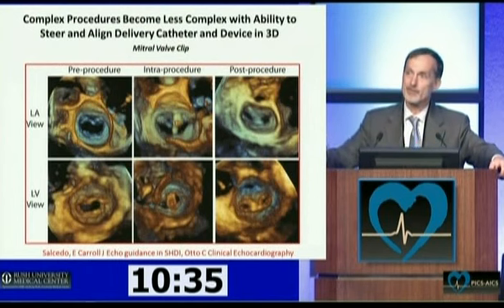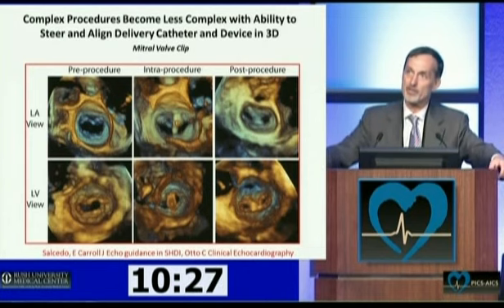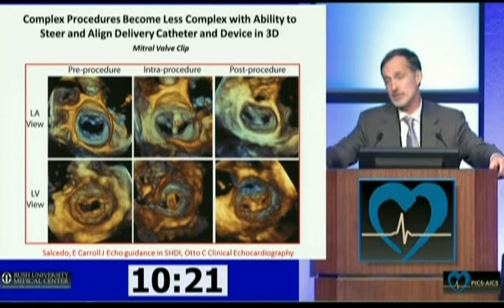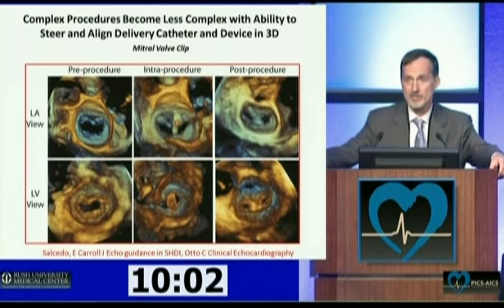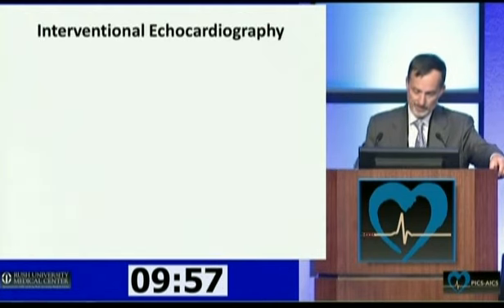And we have had very clear anecdotal but broadly agreeable changes in the complexity of interventions because of the challenges really more of image guidance, and MitraClip really is the prototype around the world of a complex intervention that's become easier because of better imaging. That allows us to see, to align in 3D space, something that we had to constantly move a TE probe around, had to integrate in our minds 2D slice images.